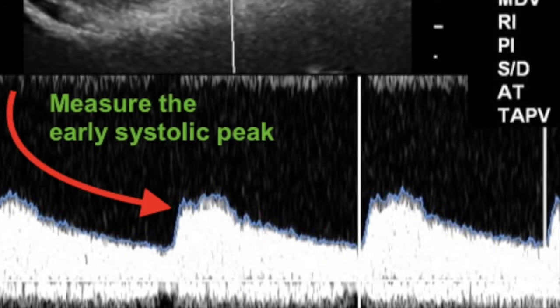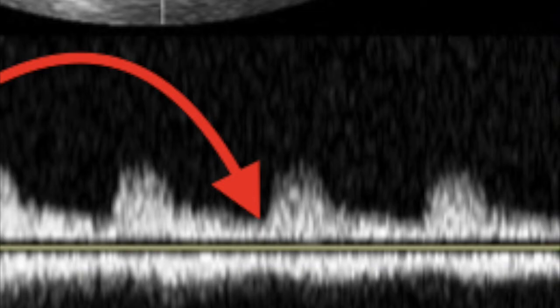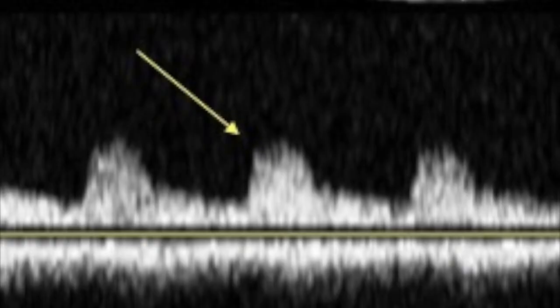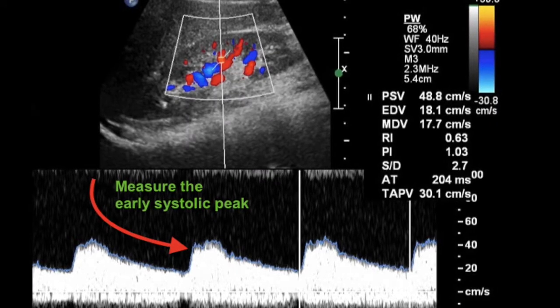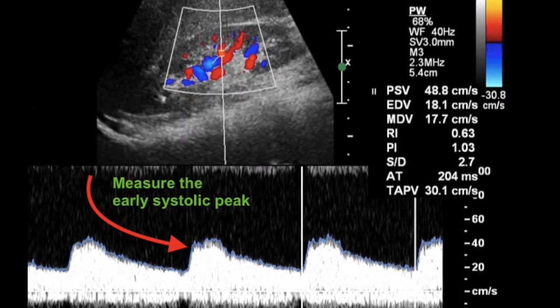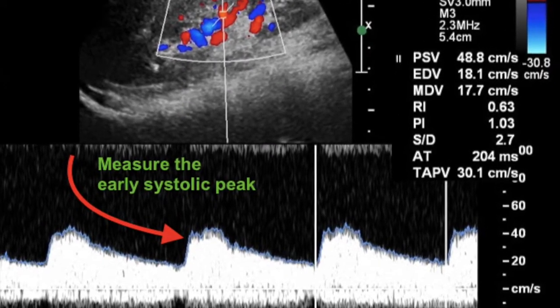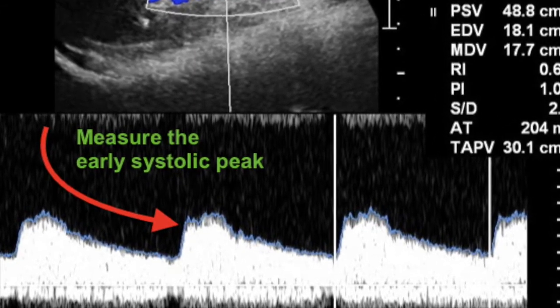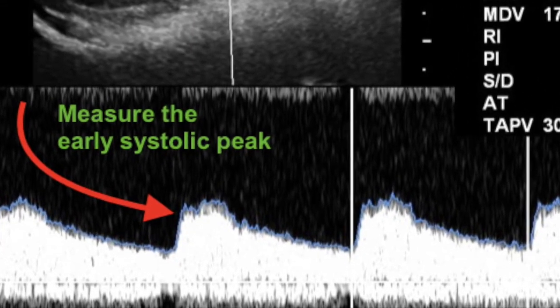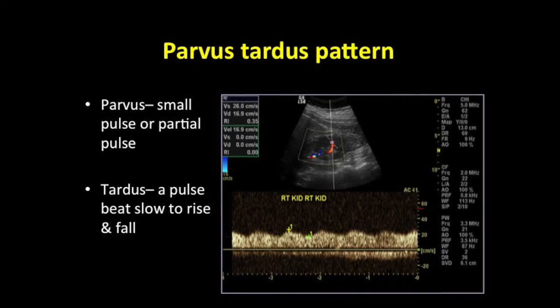The AT peak is measured from the starting point to the end point. As you can see here, the acceleration time is 204 milliseconds, which is more than 100 milliseconds. You can also appreciate visually that the pulse is slow to rise and acceleration time is increased.